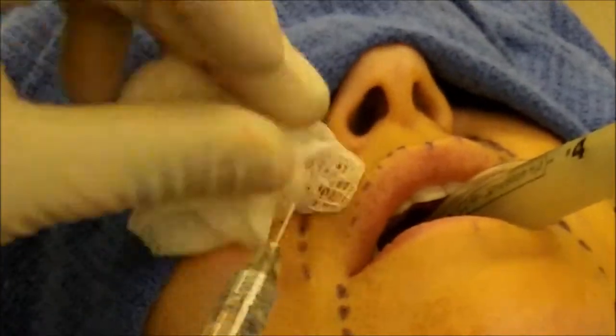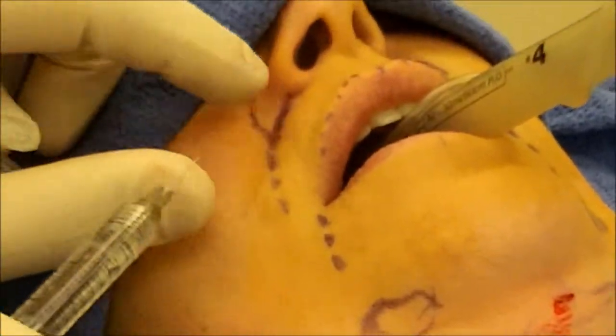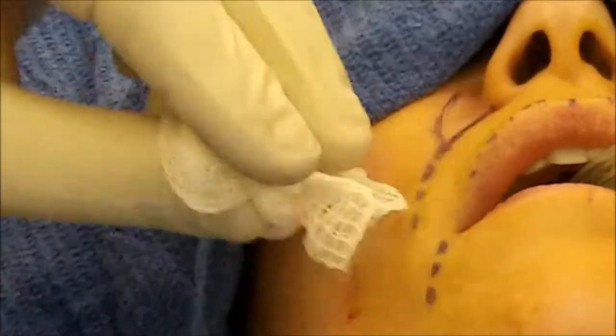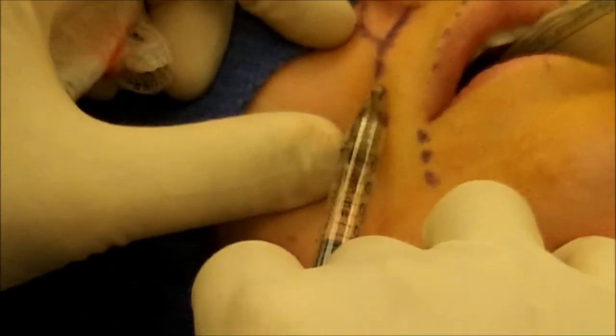After I get a good couple of passes in there, I'll pull the cannula out and massage the product in to make sure it's soft. Sometimes I'll put a direct injection right into the piriform area to give a little bit of fullness in that piriform.